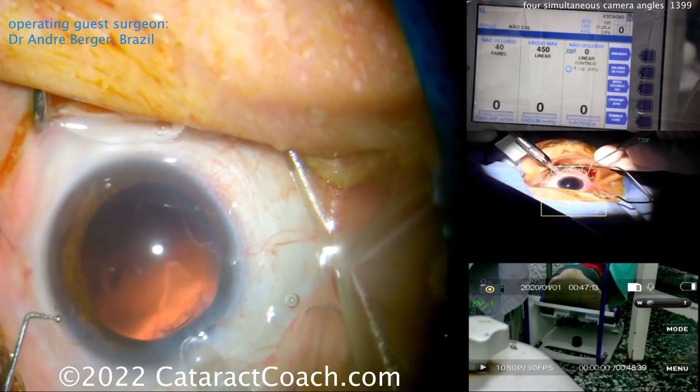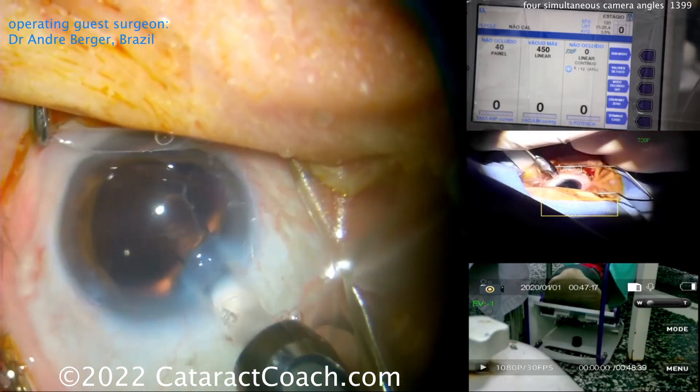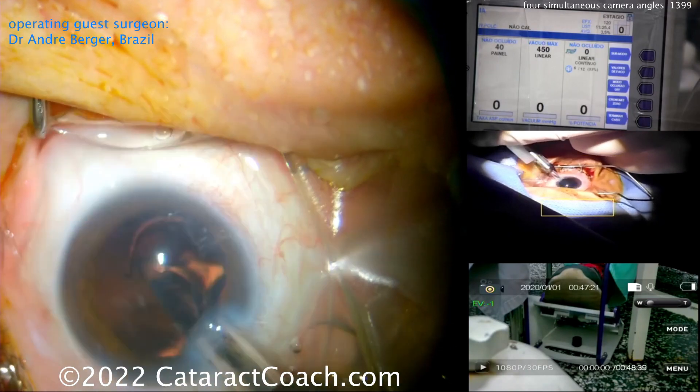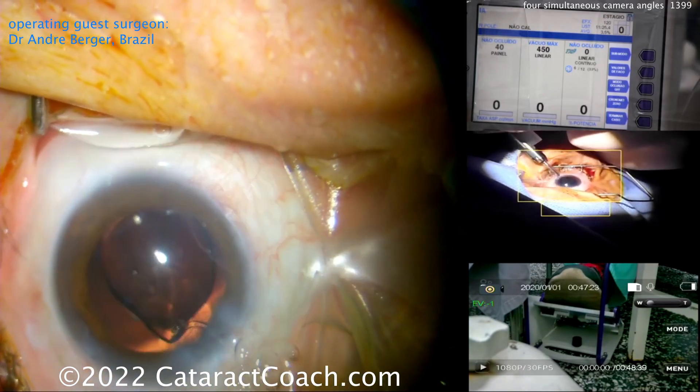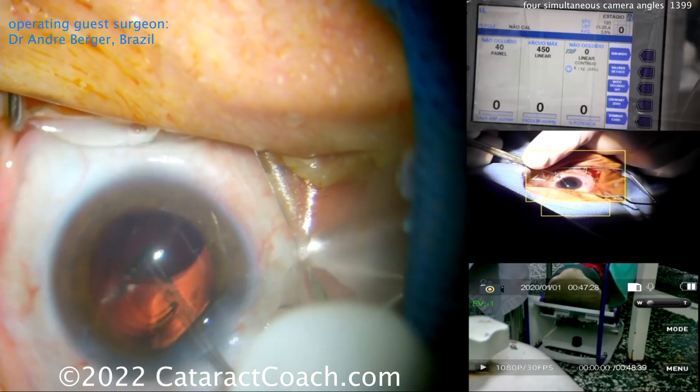Think about driving in a parking lot: you want a little bit on the accelerator or a little bit more, but you don't want to go on and off it. Here comes the lens going in the capsular bag — looks like a single-piece acrylic lens, nicely delivered — and then watch how he delivers it inside the capsular bag.